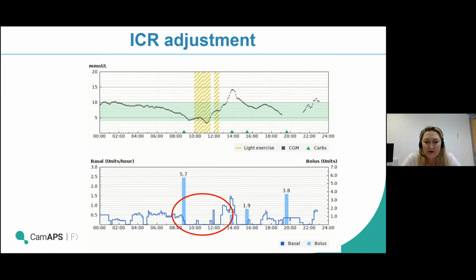So in this situation, because the bolus is too aggressive, again, you wouldn't be basing it on just one reading. Probably you're going to want to see, did we count the carbs wrong there? Was there something else going on? But if you're seeing that pattern a lot, what you want to do is be thinking the carb ratio is probably a bit too aggressive and going up 1 or 2 grams.